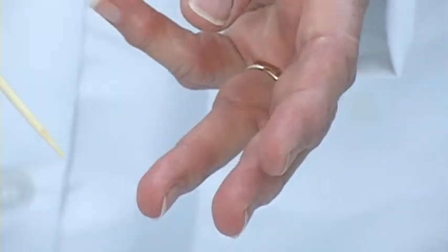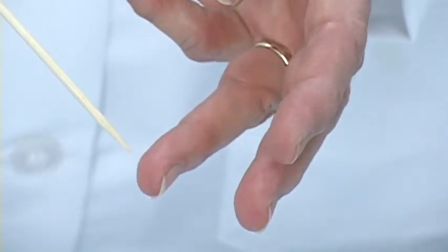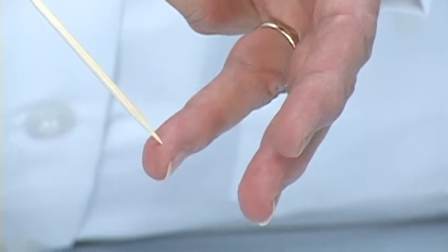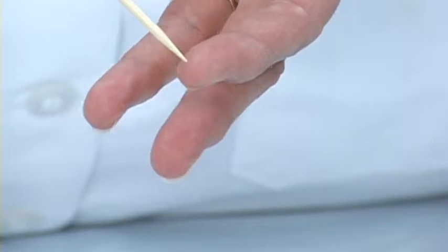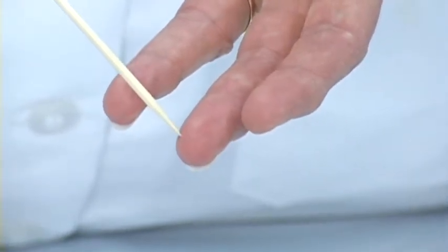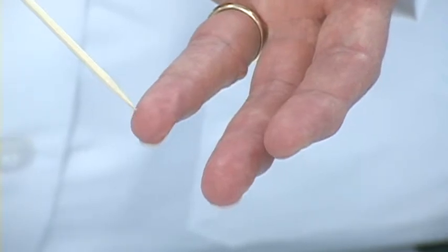It's recommended that you poke on the side of your finger where the capillary blood flow is best. And if you look at the fingertips, there's a little area where it's slightly darker. That means that there is good capillary blood flow in those areas. That is where you want to poke with your lancet device.